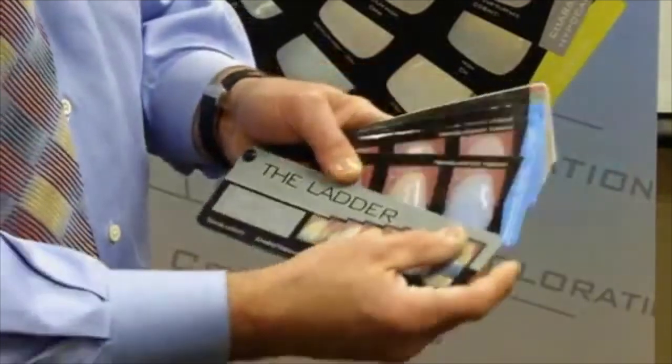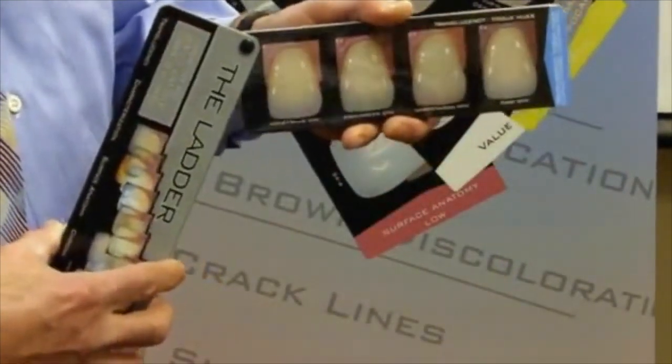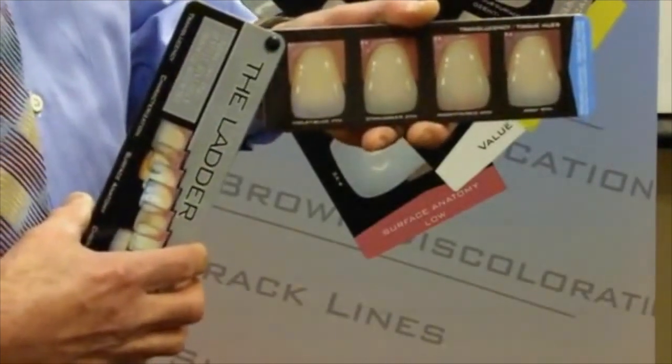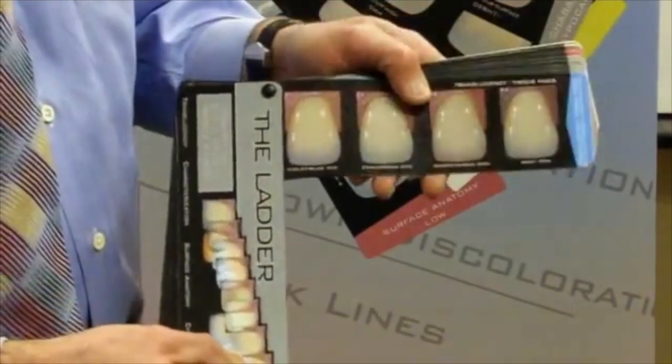I have the option of changing the hue of the translucency. So translucency normally is violet blue. It can be gray with wear. Staining will cause a multitude of coloration that is visible in the teeth.